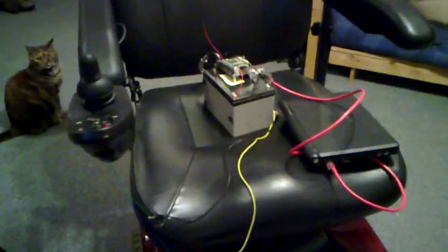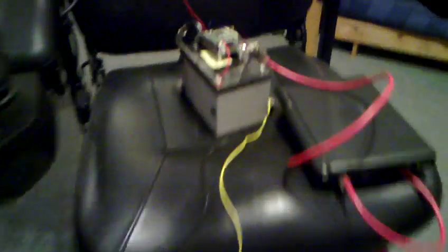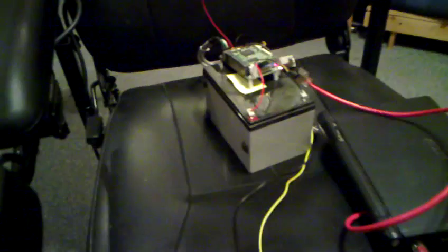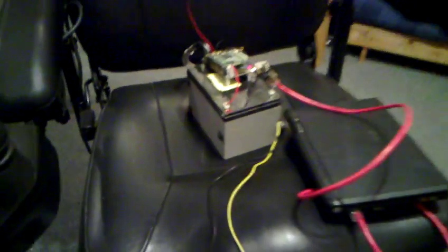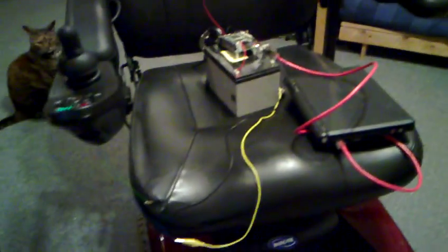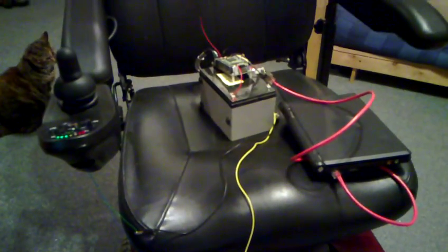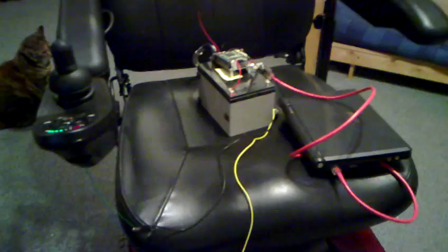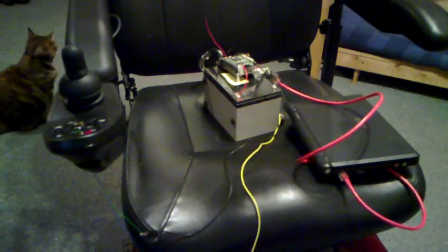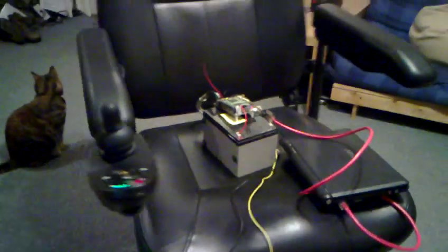So, there we go. Obviously at the moment it's just running on a little lead acid battery. I've got voltage converters so I can run it off the main wheelchair batteries, and that way we get the battery level as well.